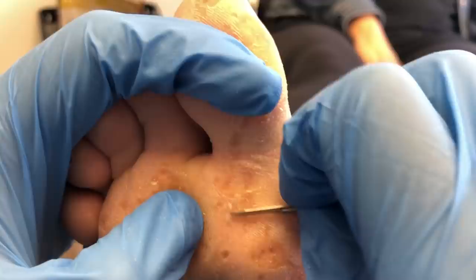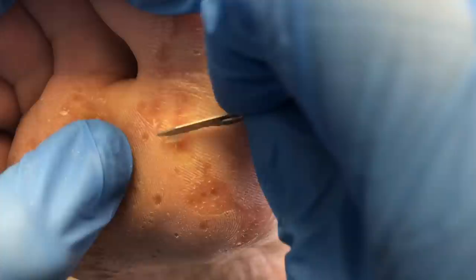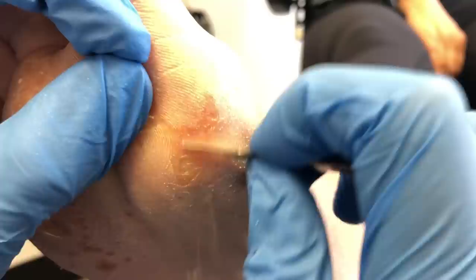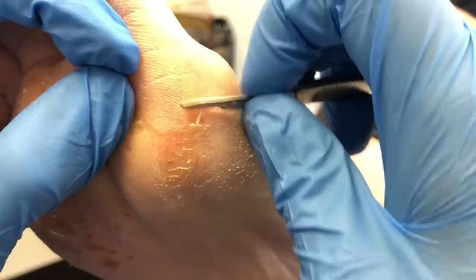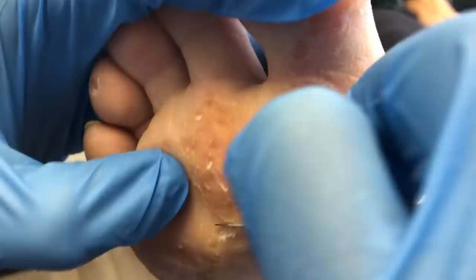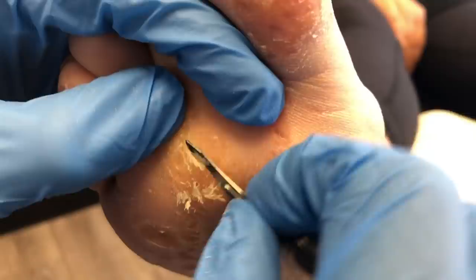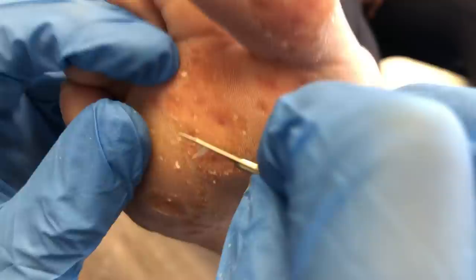Now I'm going to jump to where I switch to the 15 blade to do some fine debridement and really reduce the corns in the area. Working on the toes, you can see that callus or corns don't have to develop only in high-pressure areas — as long as there's some pressure. The 15 blade is a smaller blade compared to the 10 blade, so I'm able to dig deeper into the corn and relieve that pressure, getting more tissue off.